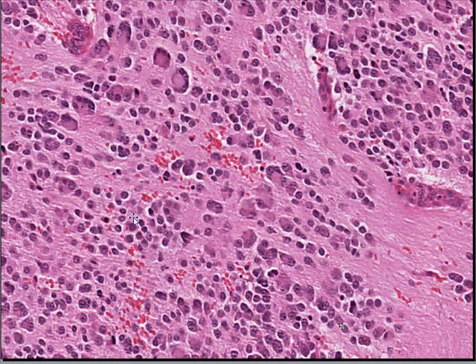Here is a type of neuroblastoma in which we see some multinucleation, like here and here and here. And this implies that it wants to differentiate even more into so-called ganglion-like cells. This neuroblastoma may be called a ganglioneuroblastoma for that reason. And like we said, because these cells have a higher degree of differentiation rather than just your classical small round blue cell tumor, this one's expected to behave more favorably as well.